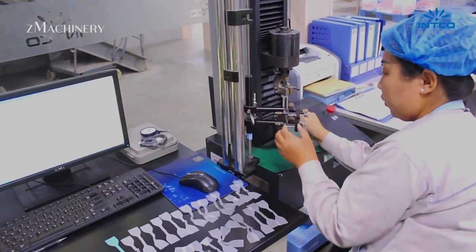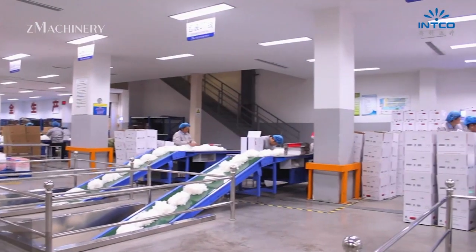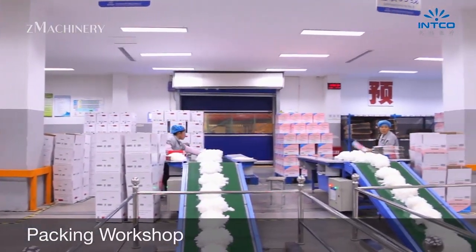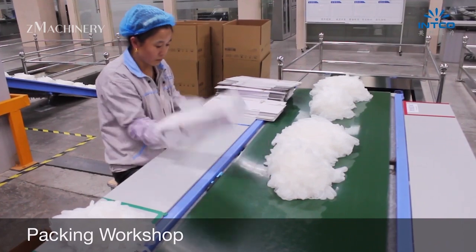Approved gloves are then counted, stacked, and automatically packaged in hygienic, sealed boxes. Final products are prepared for distribution to clients in healthcare, food processing, laboratories, and personal protection sectors around the world.